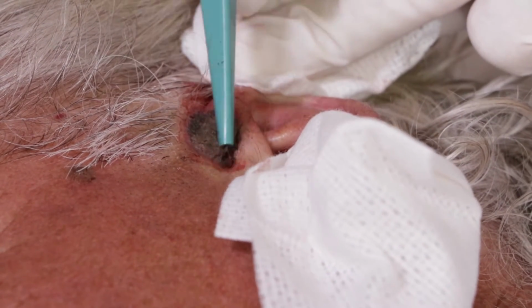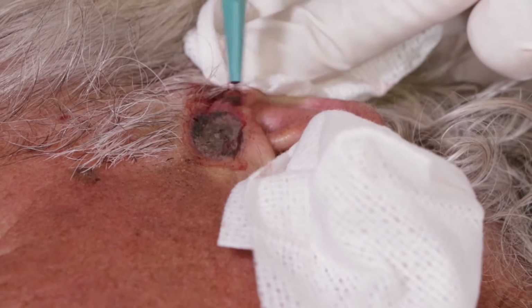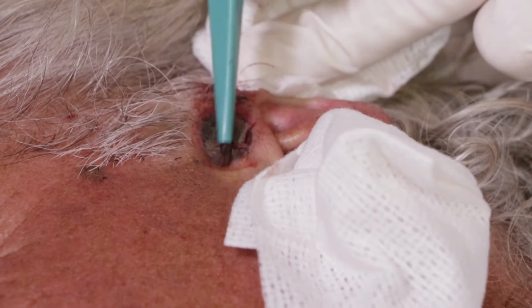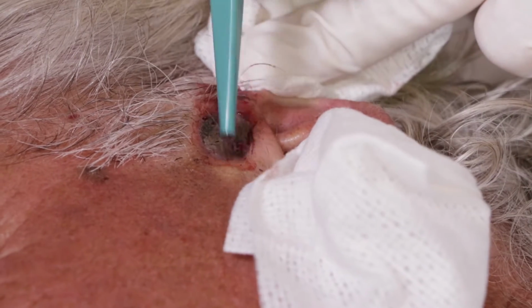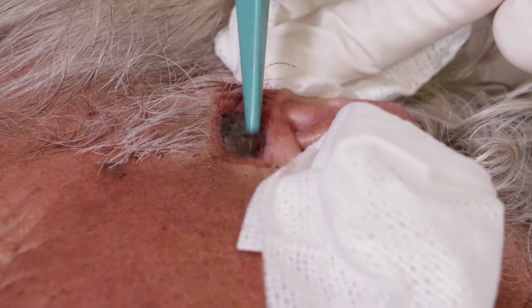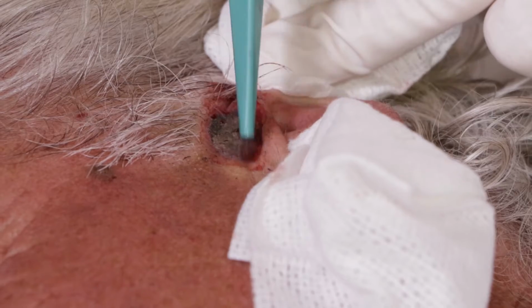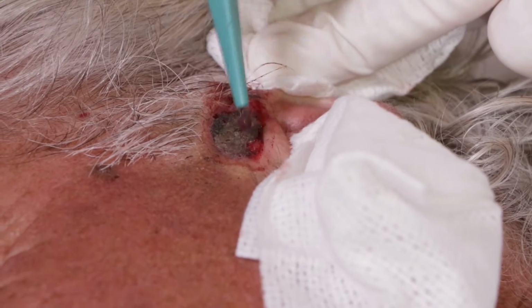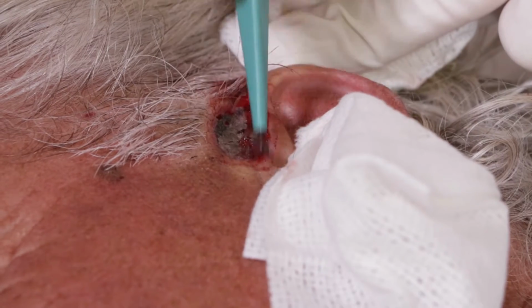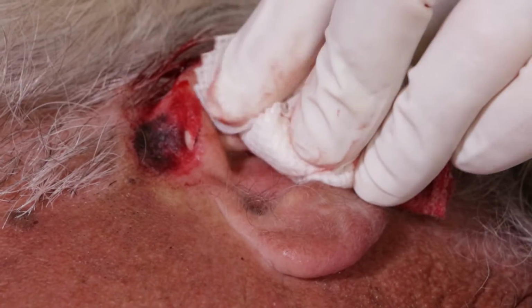Yep. Same place. I can feel it. And that is the area where there was a little crust on it. It seems pretty stubborn. It does. I would agree with that statement. Let me clean it out a little bit. How's it feel? Fine.